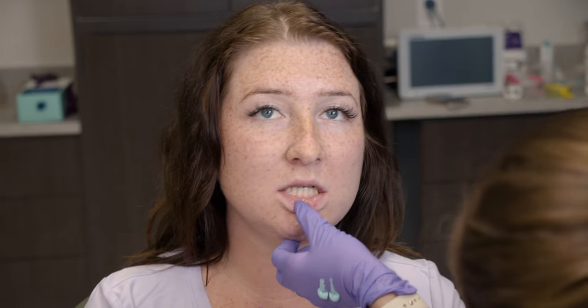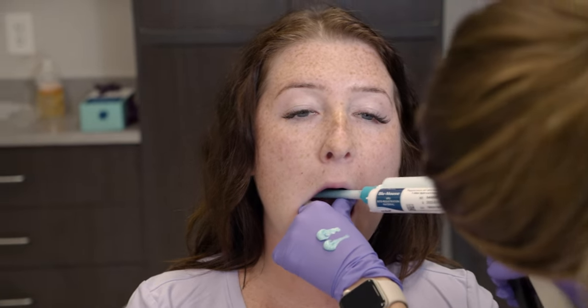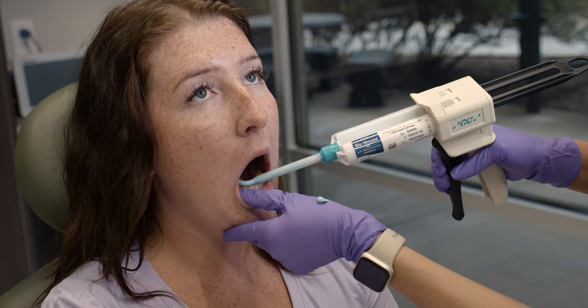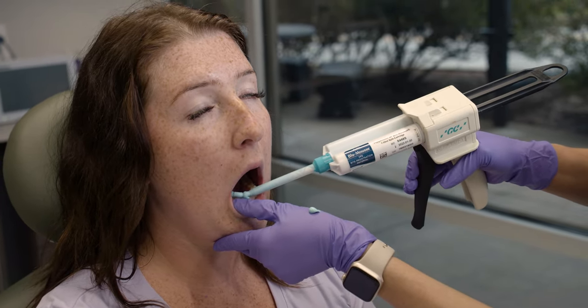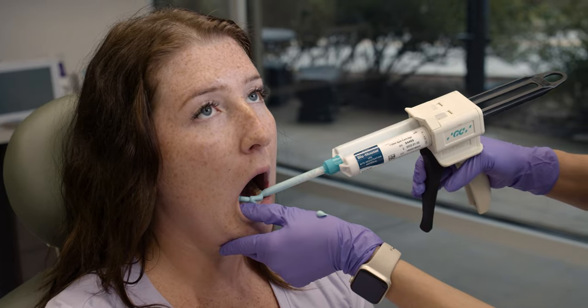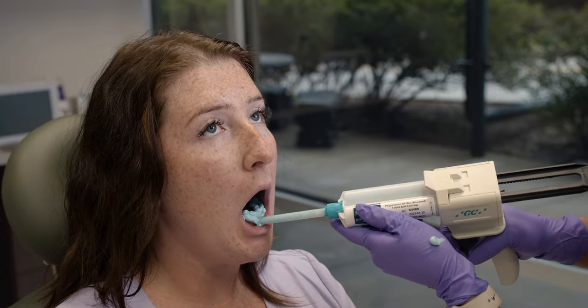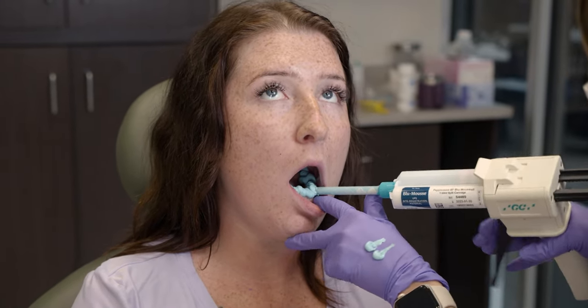When taking a bite registration, we want to capture the occlusal and incisal surfaces of all of the teeth. When applying bite registration material, always apply it to the mandibular arch. I recommend asking your patient to open and close and verify their normal and natural bite before taking the impression — practice with your patient and show them how you expect them to bite down when you put the material in the mouth.